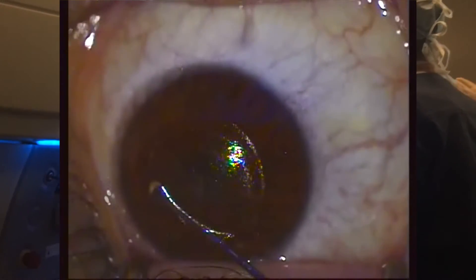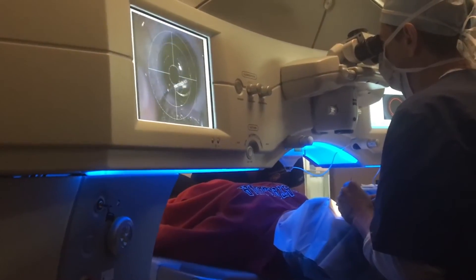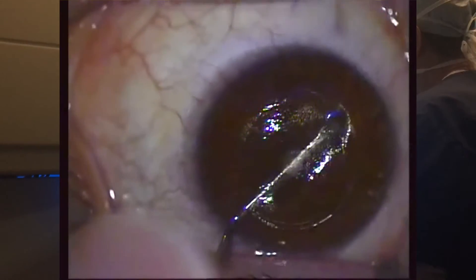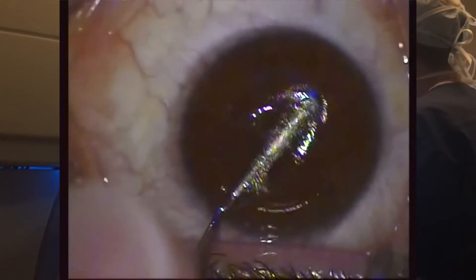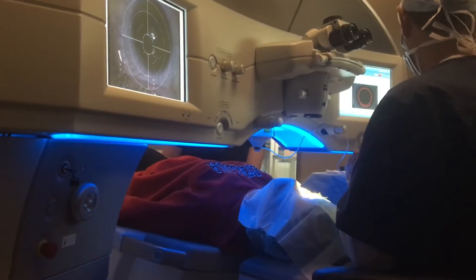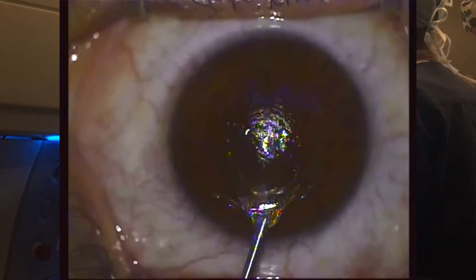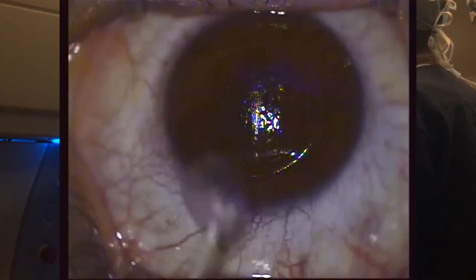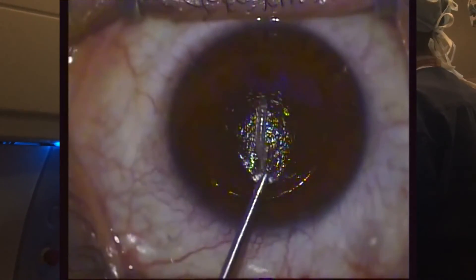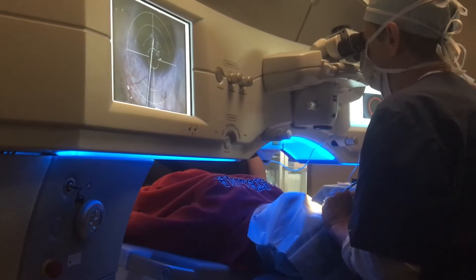The deeper refractive plane is now completed in separation as well as the internal side cut. We move all the way around to be careful that we've completely separated the lenticle and it is freely able to be removed with a pair of forceps. The forceps we use here are the DSEK forceps and these are placed inside this pocket and the lenticle is removed and placed on the cornea. There are no tags and thus the procedure is fully completed.